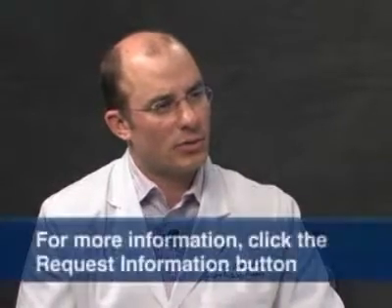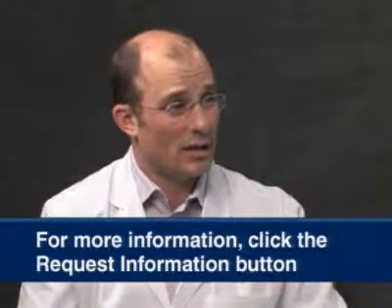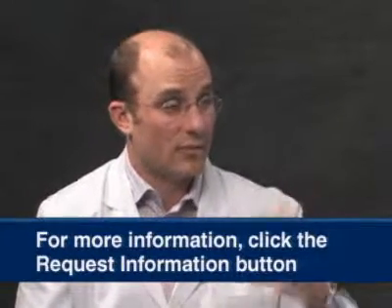Is this procedure more or less complicated if the patient has a pacemaker, which this one did have? It doesn't make a whole lot of difference, but there is a little more difficulty in getting transeptal access, getting our catheters to cross over the septum, because we have to stay out of the way of the pacemaker wires themselves. But it is kind of nice to have a pacemaker because they don't get a slow heart rate during the procedure, which can sometimes be a problem. So the pacemaker is still functioning?